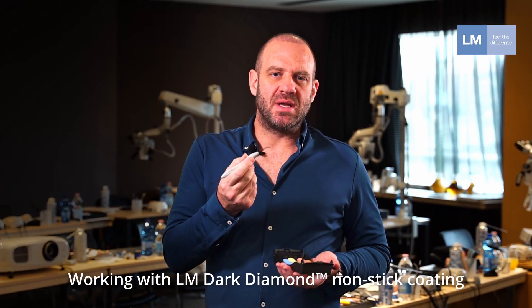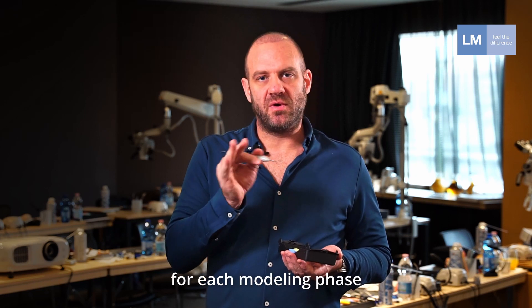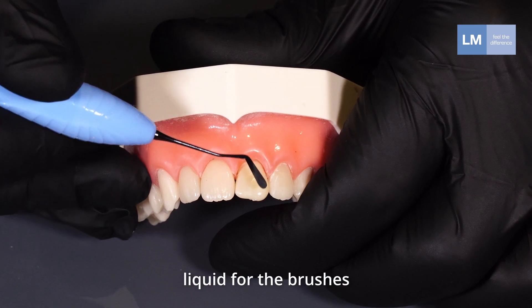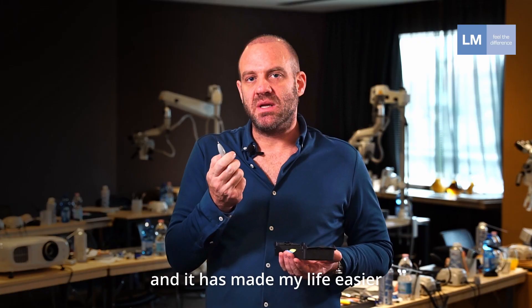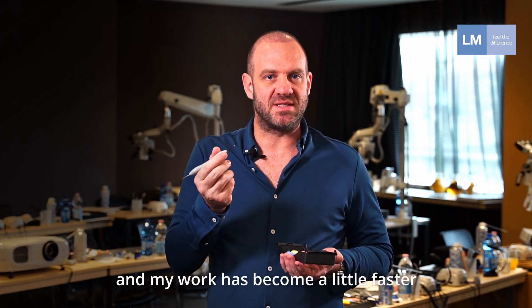Working with dark diamond has changed the way I work. I need fewer strokes for each modeling phase, less modeling liquids or brushes, and it made my life easier and my work become a little faster.